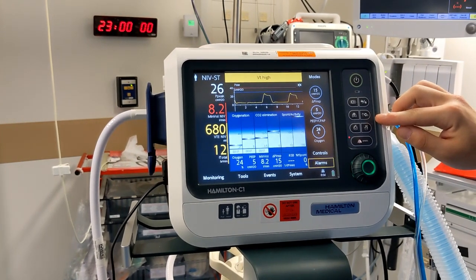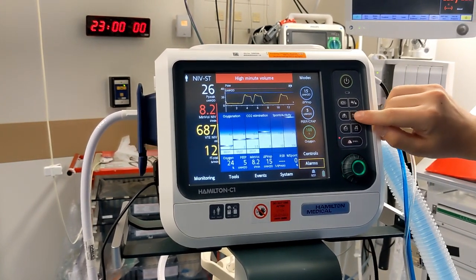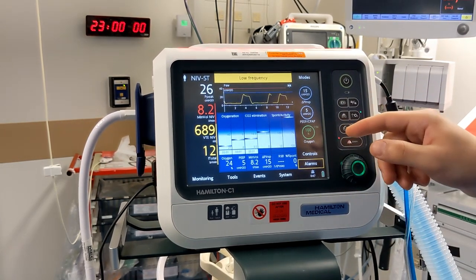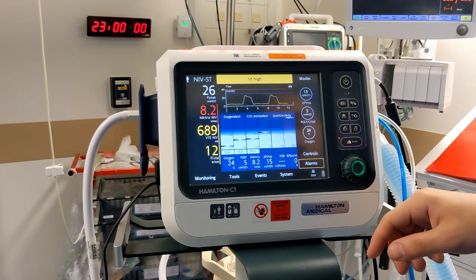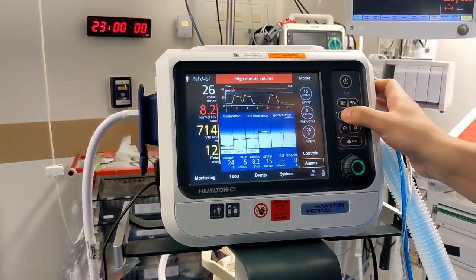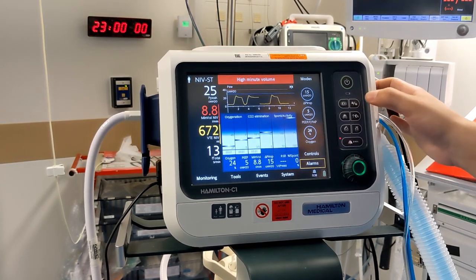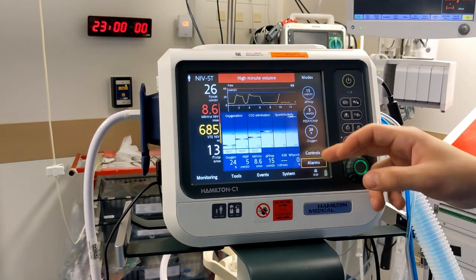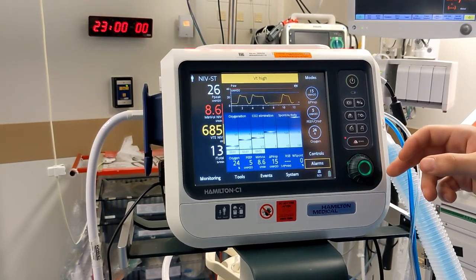A couple of buttons to note: pressing the O2 button gives 100% oxygen for two minutes, after which it reverts to your previous setting — or you can press it again to revert early. This button is the inspiration hold. This other button locks the screen and does nothing if you simply tap it.